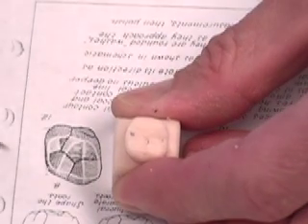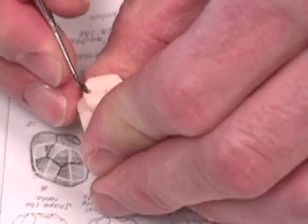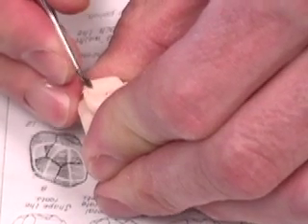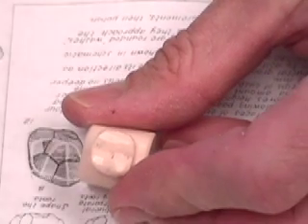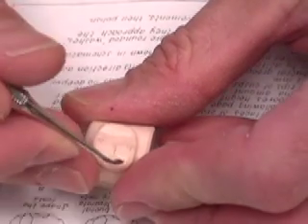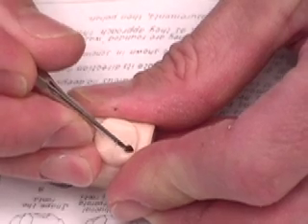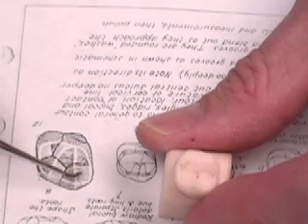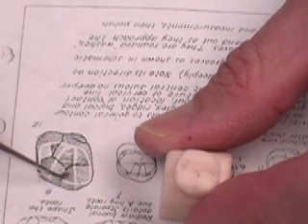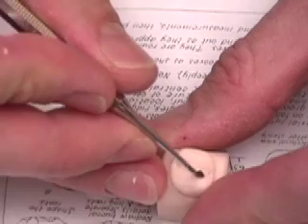Now we're going to form this pit right here. Now that we've formed those pits, I can start to connect them. I'm going to take the sharp end of the clioid discoid and basically take the tip of that clioid discoid and start to form planes. If you look at the picture, you've got a plane and a plane and a plane — several intersecting planes. That's what we're going to try to do.